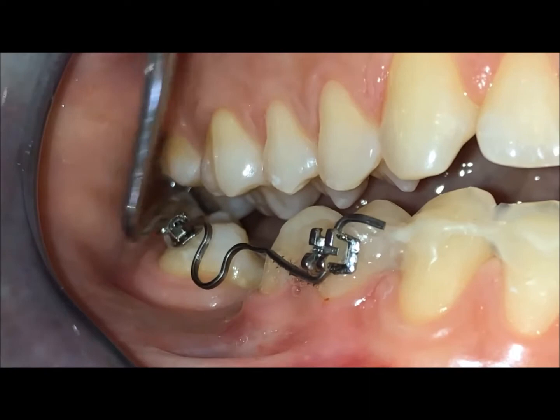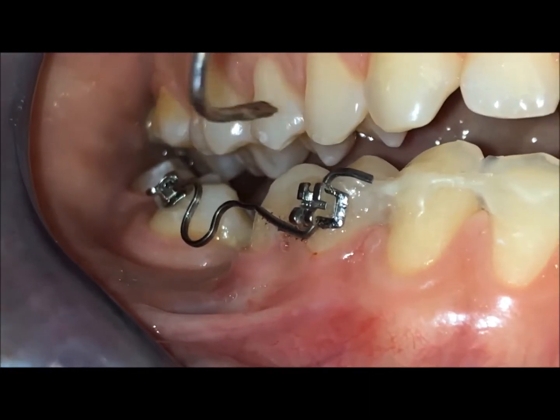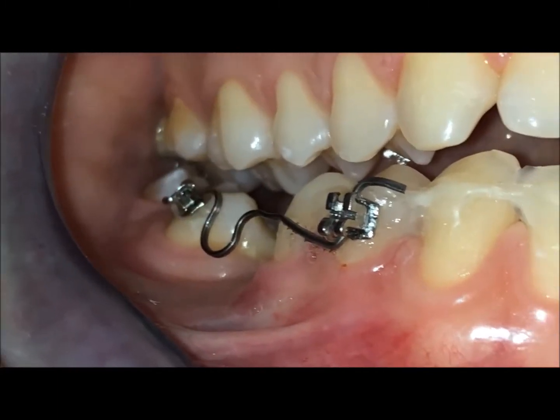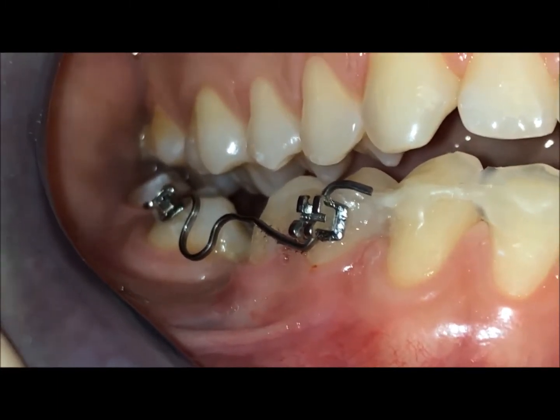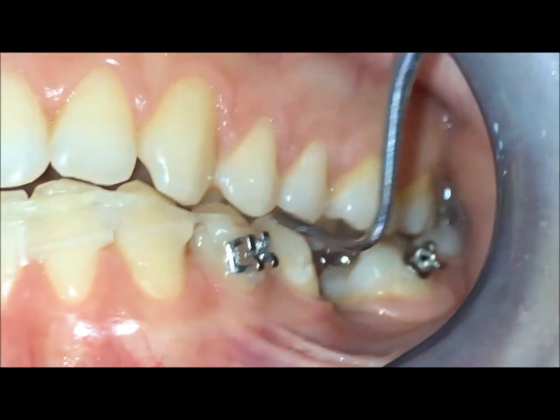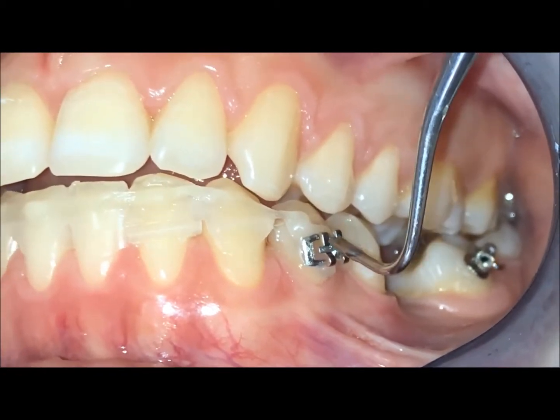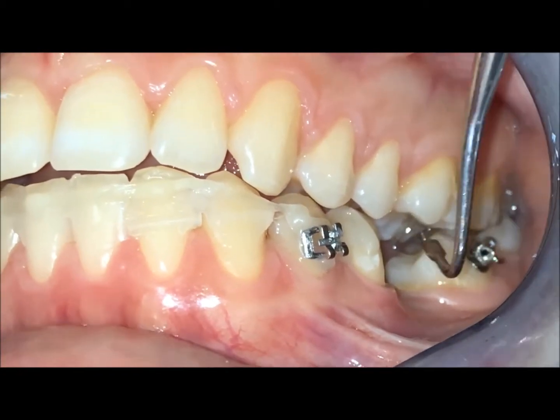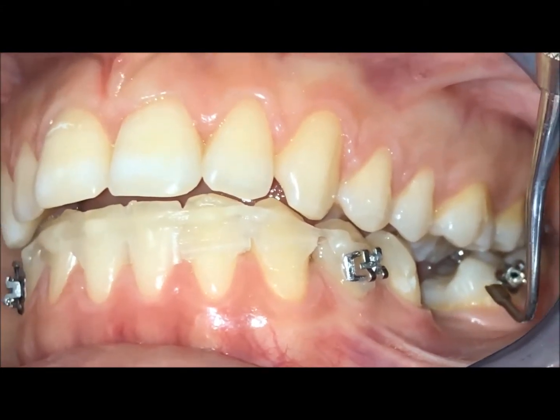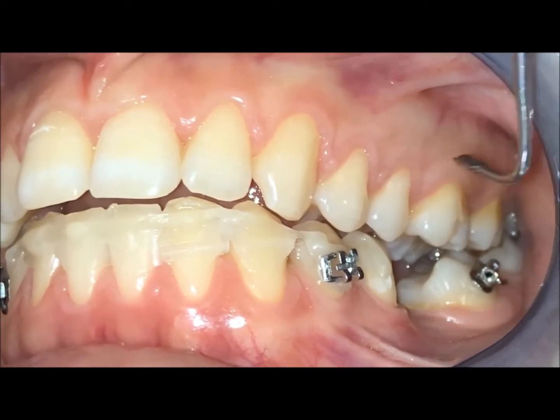After we will move also the molar, because now we need maximum anchorage. We didn't use a mini-screw anchorage here because the patient cannot do a mini-screw for some reasons. Now we have to do the same sectional also from this side — mesialization of the molar and the uprighting, so a mesial movement also of the root, in order to have a bodily movement.